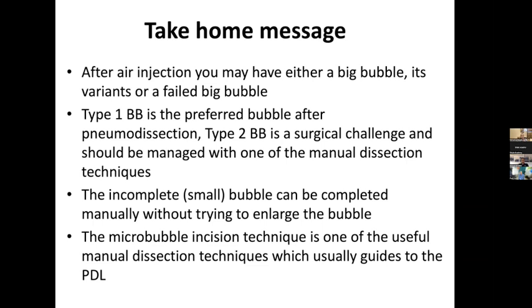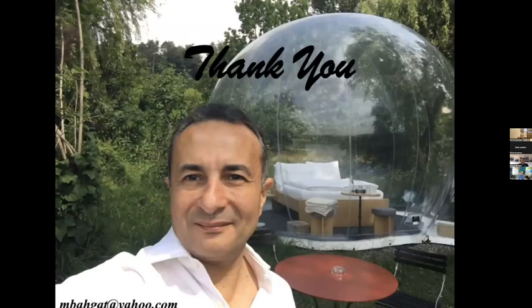The microbubble incision technique is one of the useful manual dissection techniques, which usually guides to the predescemetic layer. And remember that the big bubble usually makes the life of a corneal surgeon easier, and this is my preferred bubble to live in. So thank you.